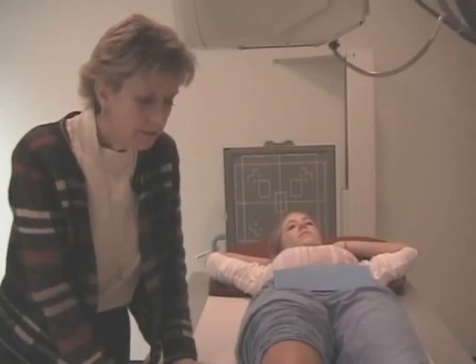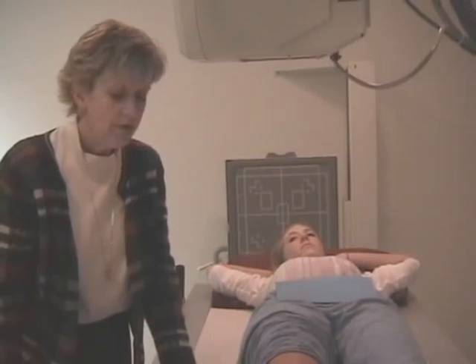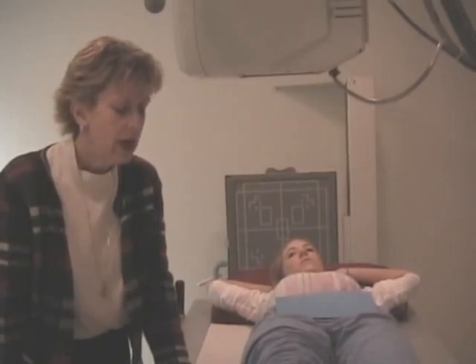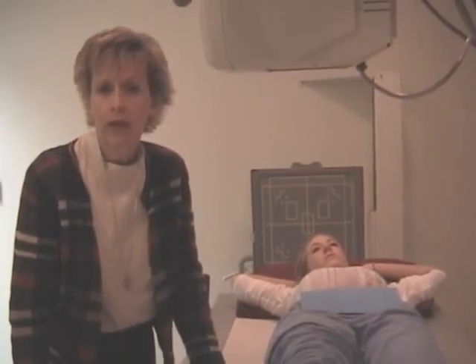So I think I've discussed different scenarios that you might face with the AP knee. I reviewed the centering portions. On a radiograph, if you evaluate your effectiveness, the tibial plateau and the intercondyloid eminences should be cleared from the femur, and the patella should be lying slightly medial in evaluating your film. Tight collimation because of the automatic exposure control. Without tight collimation, the cell is going to pick up density from the tabletop and terminate your exposure earlier, and you'll end up with a light density radiograph. That was the AP knee.